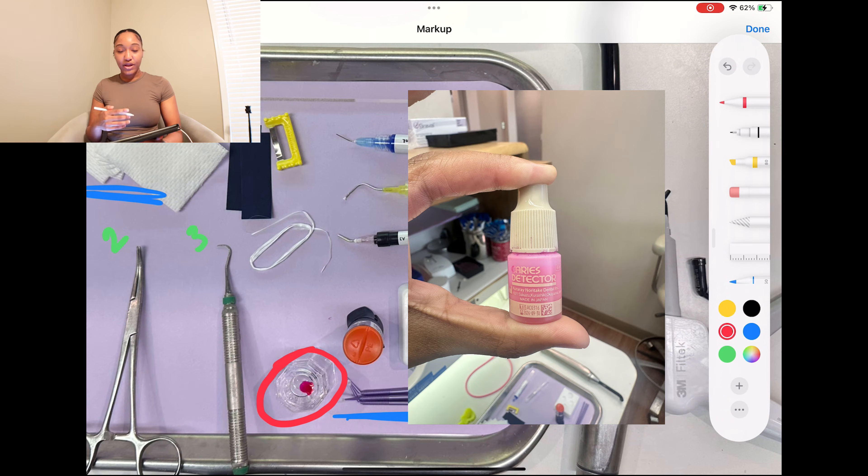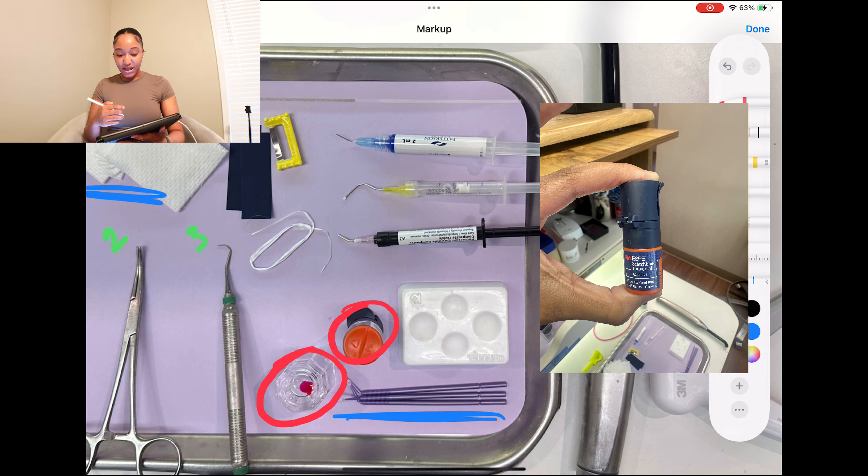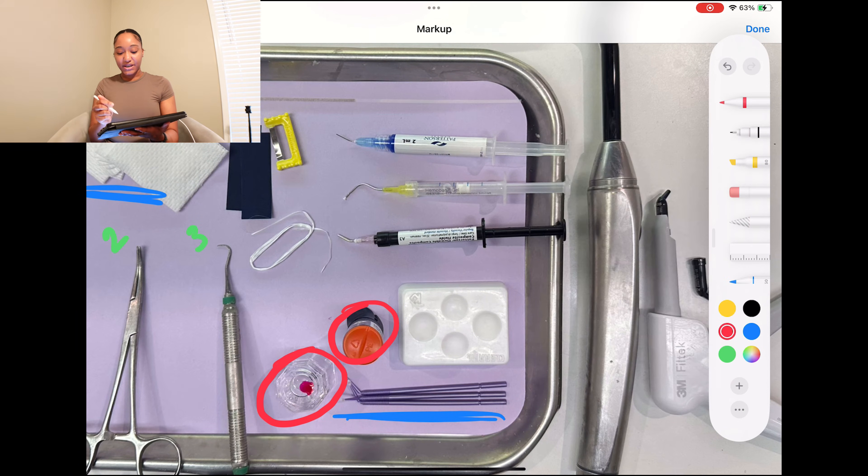Let's go ahead and identify some of our products. This right here is going to be my caries indicator. Caries indicator is pretty much used to highlight damaged dentin — it's placed on the tooth to highlight the damaged dentin or damaged protein that builds up the dentin. You have to still get it out because that means that's decay. Here is my bond, sitting right next to the dappen dish. I just have it flipped upside down because usually I squirt my bond out and place it over the little hole — bond is usually yellow.